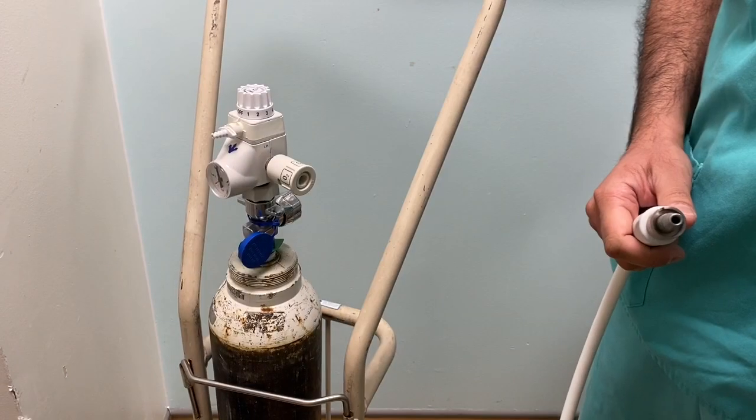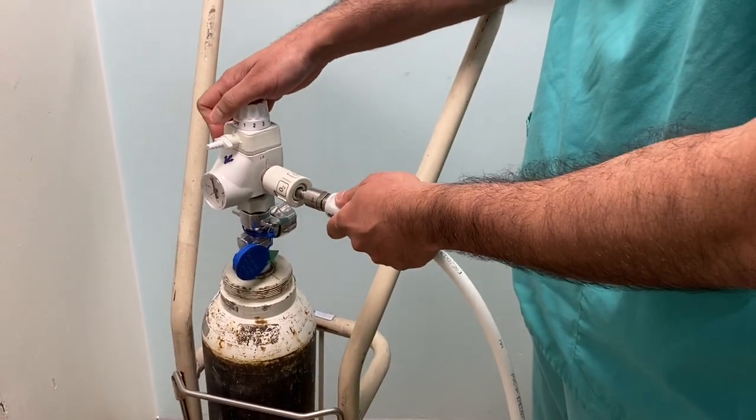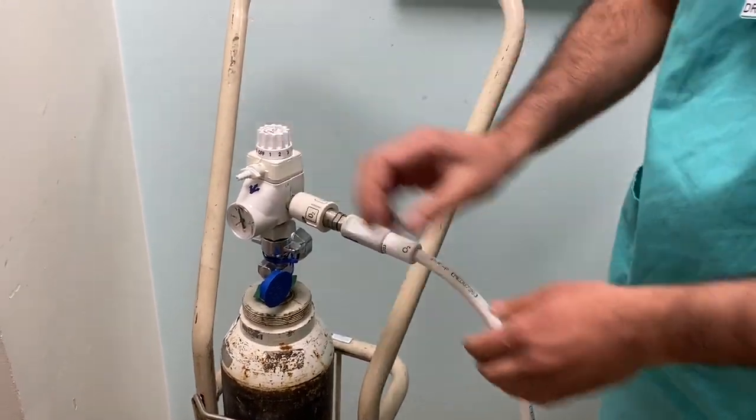If you're in the respiratory ED, the Schrader valve will go directly into the oxygen cylinder like so. It is a bit stiff so give it a good push until you hear the click, then a gentle tug to make sure that it is secure.